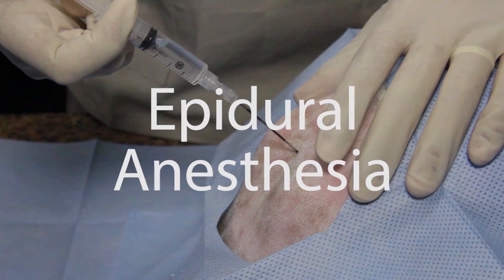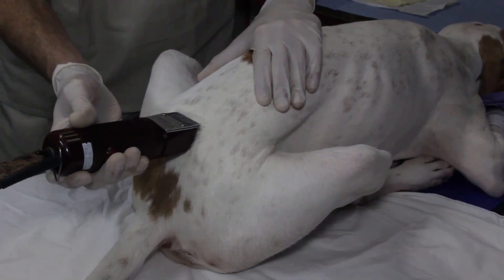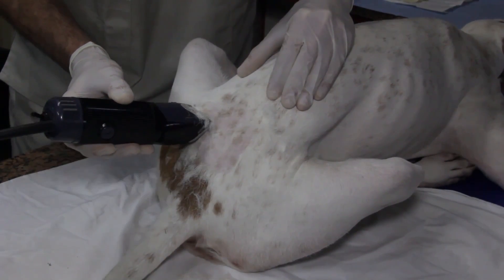Lumbosacral Epidural Anesthesia. With a dog under general anesthesia, a large square is clipped over the lumbosacral region of the spinal column, whilst the dog is in sternal recumbency.